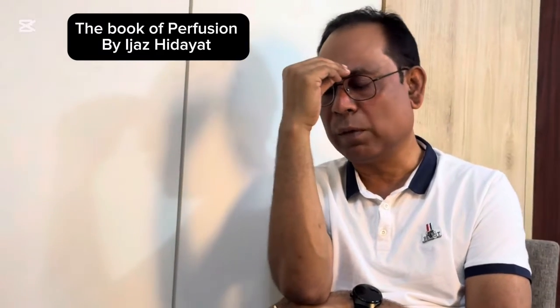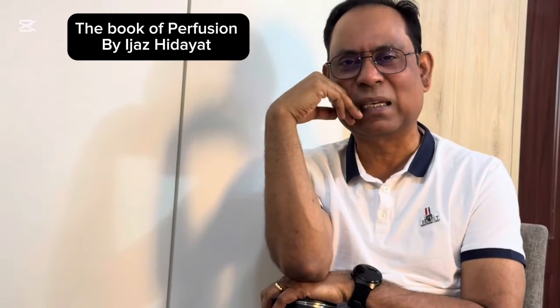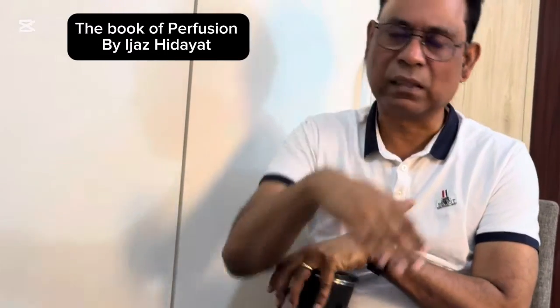Now, cannulation completed. Now we'll talk about the perfusion management. First of all, don't keep the pressures above 70, because the patient's connective tissues are fragile. So try to keep the pressure around 50 to 70. Don't go more than 70 to avoid any further dissections or any hemorrhage due to the fragile tissues.